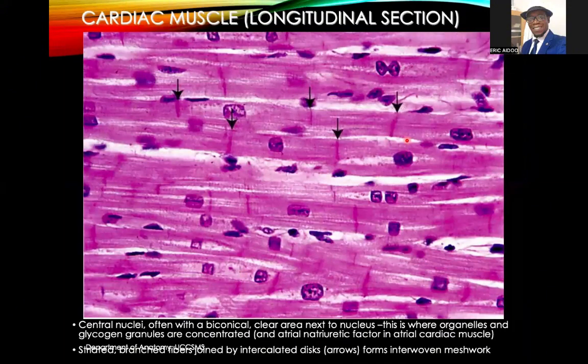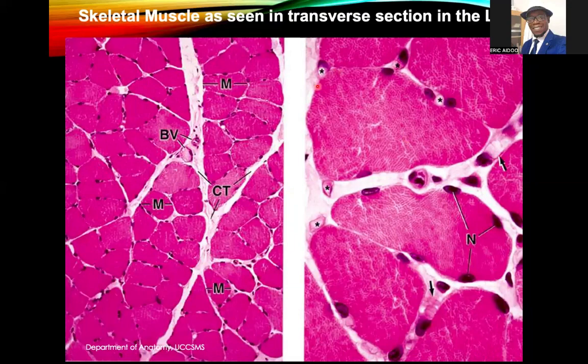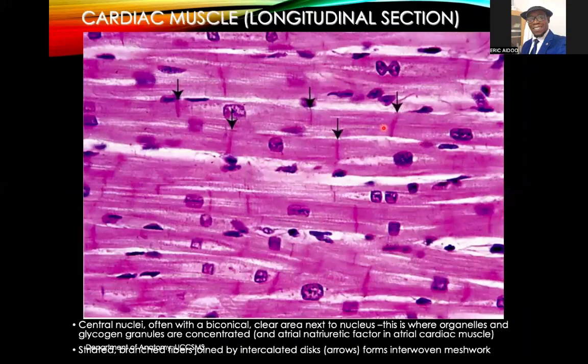So that was for skeletal muscle. You should be able to tell — once you see the multinucleation and then the superficial positioning of the nuclei, that should be skeletal muscle. You shouldn't confuse yourself at all.